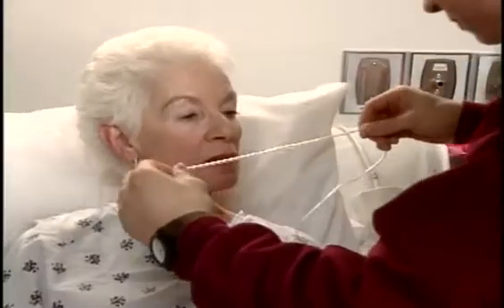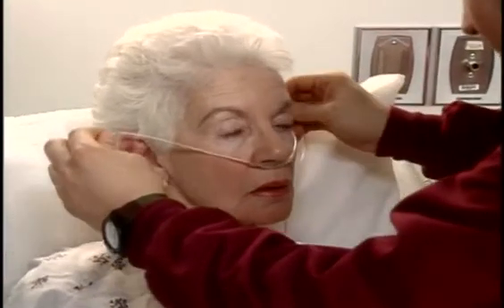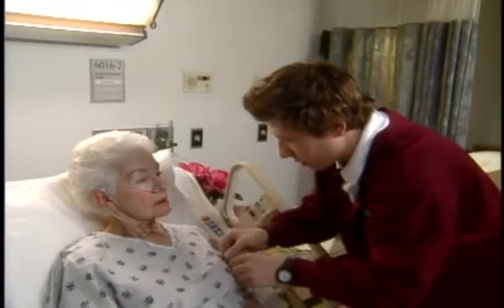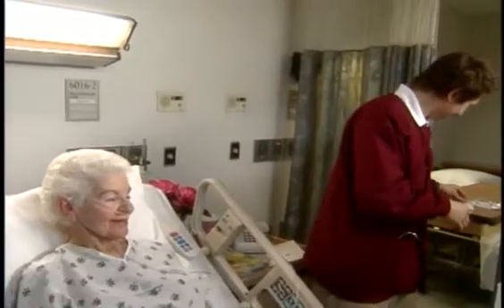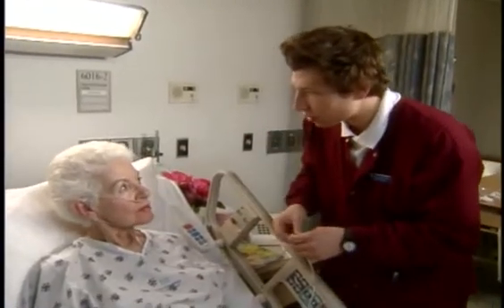Okay, Mrs. Keene, I'm going to put this on you now, okay? Perfect. Now, if the prongs are curved, the curve should follow the angle of the nose with the points down as they enter the nostrils. Now I'm just going to loop the tubing around your ears. How's that? Just fabulous. I feel like a real patient now. Now, using gauze pads, I'm just going to put them under the tubing of your ears to relieve the pressure.